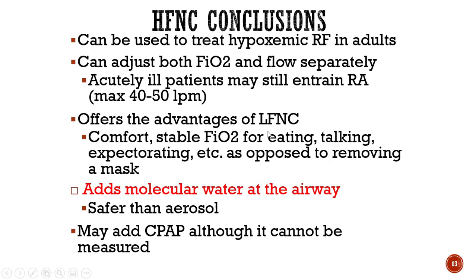And then what this was supposed to be, and I'm not sure why this got in here, because I'm realizing this during our recording, which is always my favorite time to realize that I have a typo. This is supposed to be offers the advantages of a low flow nasal cannula, not comparing it to a low flow nasal cannula. So I'm just trying to draw a comparison that it's very similar to if you were looking at a low flow nasal cannula versus a simple oxygen mask.